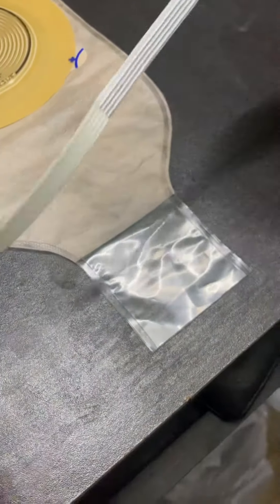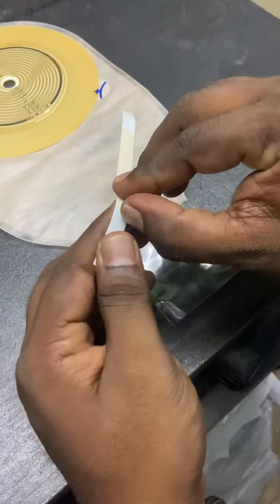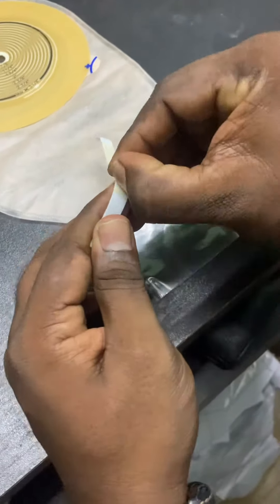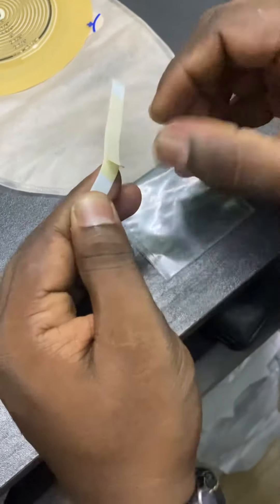Just take it out, and here is the additional part — take out this addition sticker also.